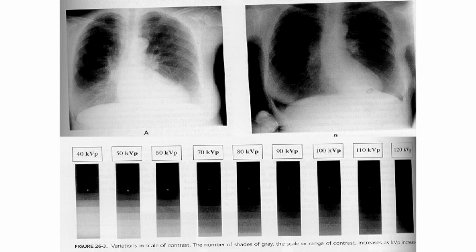Same person. Okay? So, di ba ang linaw, wala yung opacity sa left lung. Eh sir, ano po yung parang konting opacity doon? So, ayan, parang ano lang siya eh, hindi naman siya opacity, parang shadow siya ng breast. Okay. Pero syempre, kung radiologist ang magbabasa niyan, reject yan, yung letter B. That's a reject film.